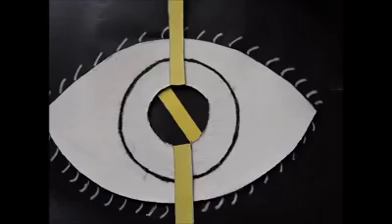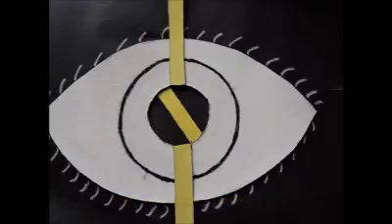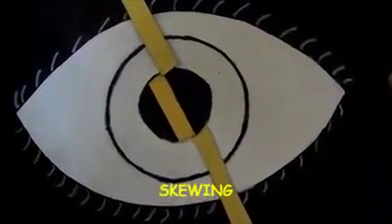For an astigmatic eye, we can determine and refine the axis using the break phenomenon. When we keep the streak at 90, the pupillary reflex sometimes is seen obliquely, that is, the axis is present. The procedure is to align the streak along with the pupillary reflex. To confirm whether the axis is correct or not, we perform a technique known as skewing.